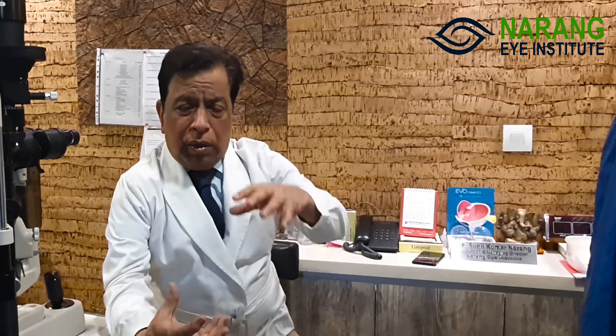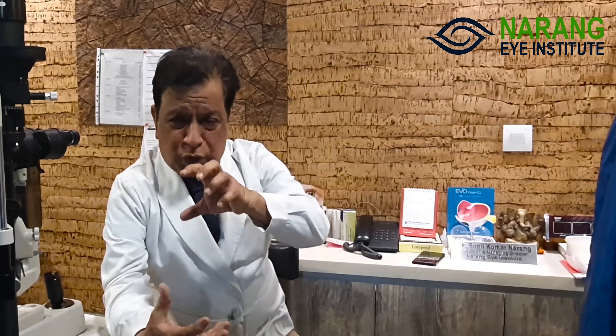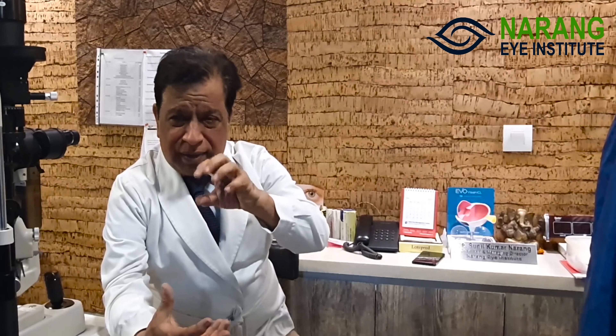For ICL implantation, we need to assess the anterior chamber. The anterior chamber depth needs to be at least 2.8 mm. ICL is made of a special material — a polymer that is a patented material from a USA company. This is a highly biocompatible material which will not cause damage even over 50 years.